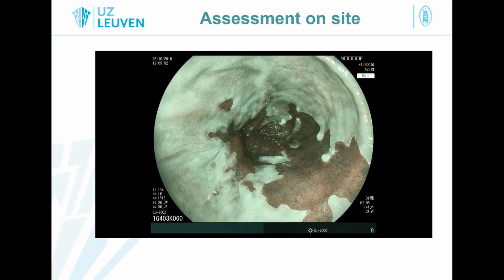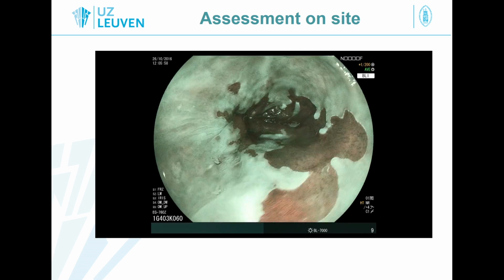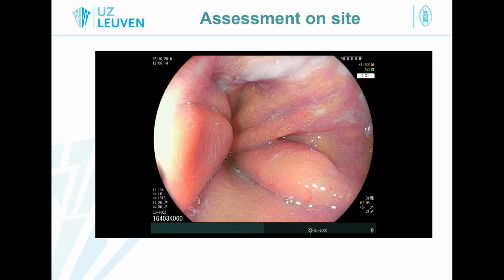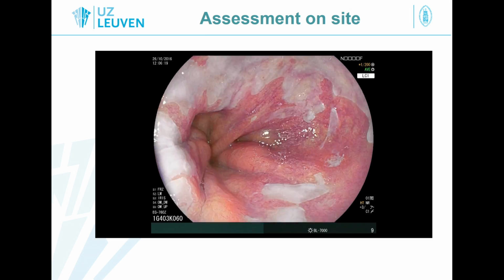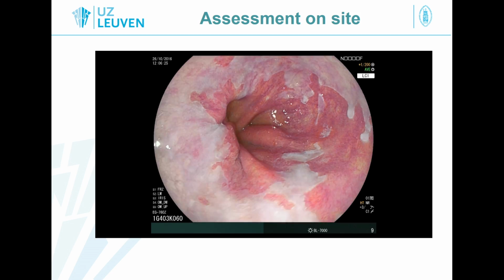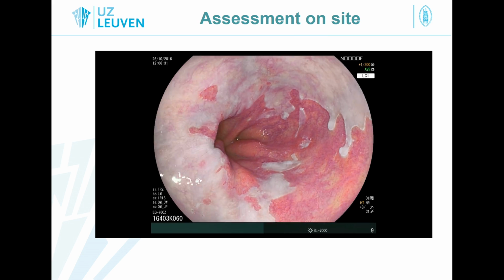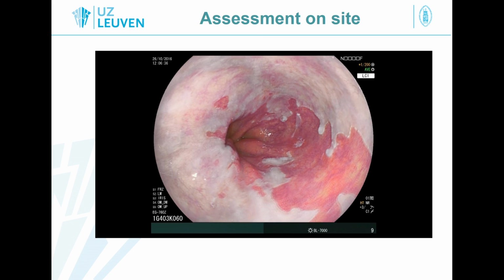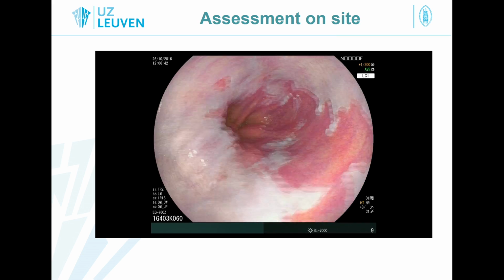Philip? Yeah. Here? Okay. Yeah, exactly. And why did you see it? Why could you pick it up? I think there's some depression or erosion around it. Yeah. So this is indeed a previous biopsy site, and what you could see is that around it the vasculature has changed. There's a discrete change in vasculature, so the vessels are a little bit more irregular in comparison to the rest. This is the LCI mode.